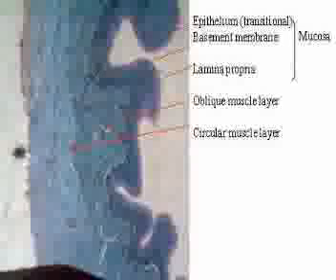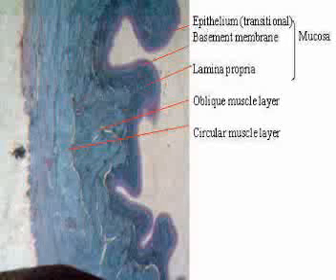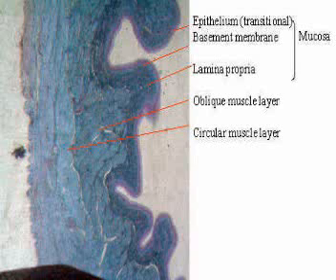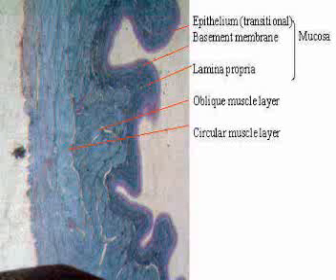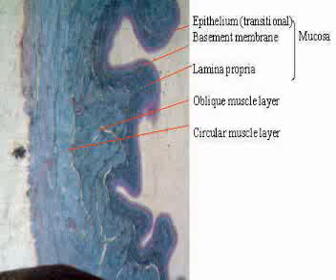The urinary bladder has transitional epithelium which lines its internal surface. It is a leakage-proof epithelium which does not allow urine to be absorbed back into the blood. The urinary bladder can be confused with luminal organs with large outer coat musculature such as tongue and esophagus. Esophagus and tongue have stratified squamous epithelium while the urinary bladder has transitional epithelium.